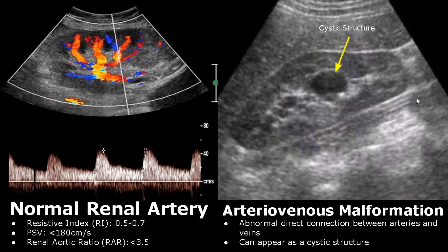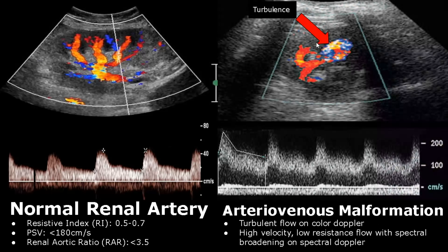Renal arteriovenous malformation is an abnormal direct connection between arteries and veins. Without Doppler, it will look like a cystic structure in the kidney — a non-specific appearance. However, on color Doppler, we will see turbulent flow inside the cystic structure with mixing of colors. On spectral Doppler, high velocity flow is noted. You can see peak systolic velocity crossing 200 centimeters per second. There is also spectral broadening due to turbulent flow.